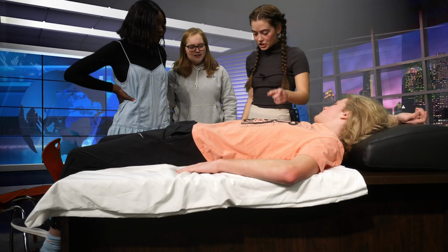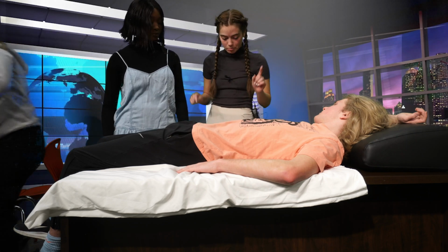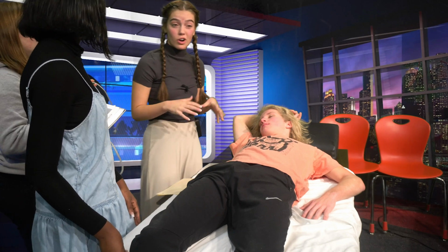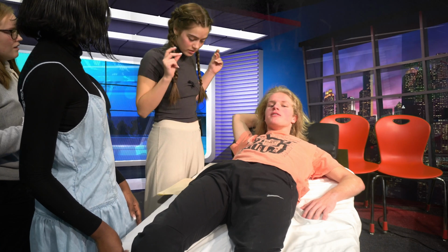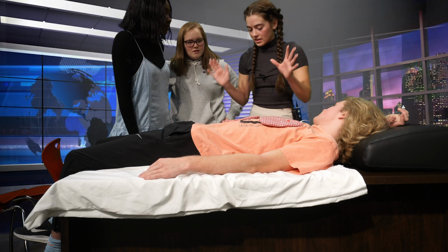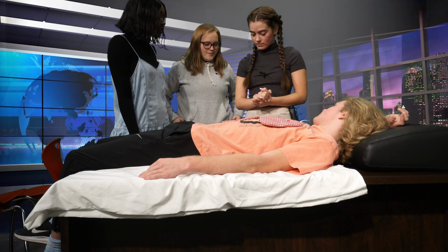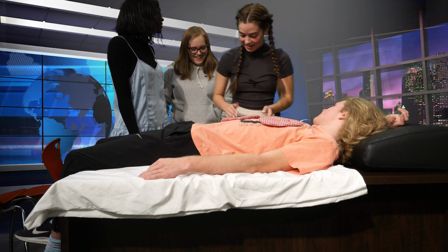Make sure the patient is dry. Okay, turn on the AED. Go get the defibrillator. Okay. Prepare the chest area. So usually you'd want to remove any articles of clothing, so we will not be doing that today. Got it. Okay. I'm gonna place these right here and right here. So we're gonna analyze, and if it tells me to shock, we need to shock him. Okay, step 10, shock the victim if necessary.